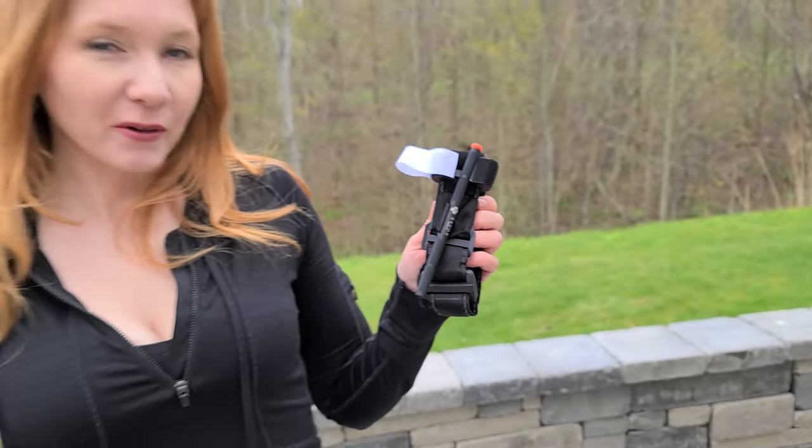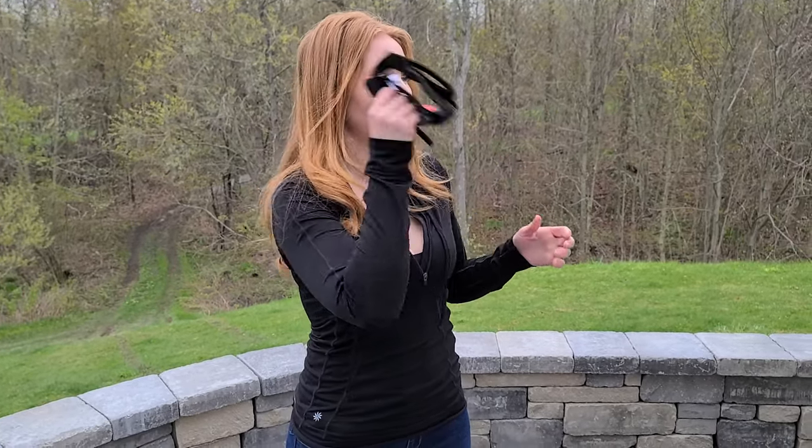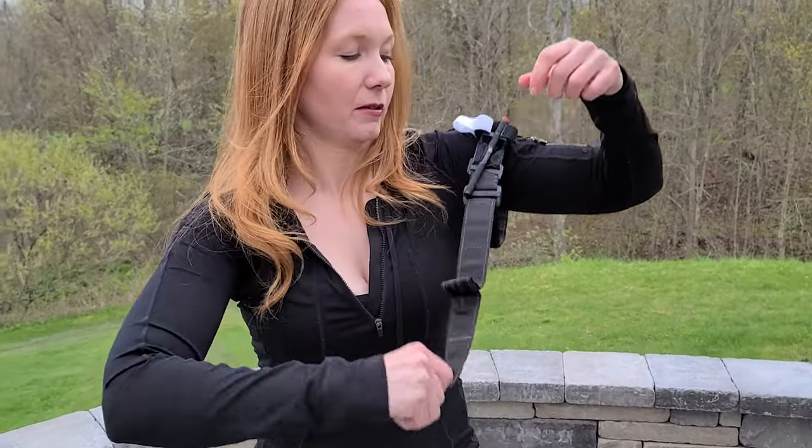Now let's talk about why we went through all that trouble to have it staged that way. If I needed to use it on myself — hands wet and muddy, under stress — it's going to be easier to use it this way. We can take it with one hand, grab it, shake it out, put it on, grab the red tab, and easily get it around. We're going to do a full video on application and use on our Patreon channel, so if you want to watch that, head over to Patreon. That was just one quick way we found it really useful, especially for staging it for yourself.